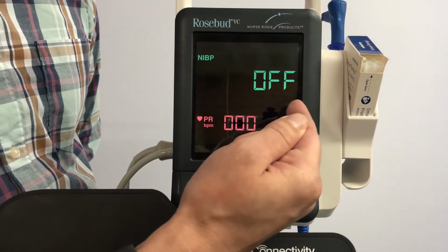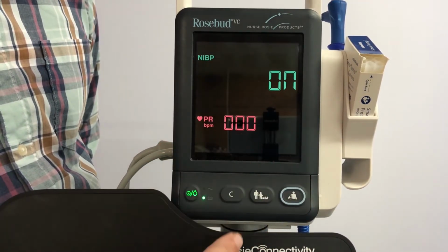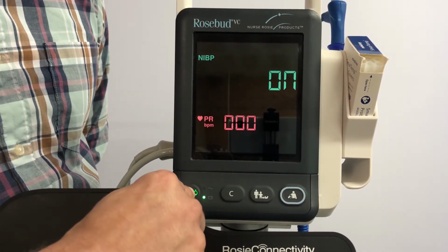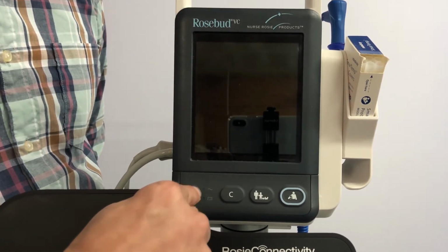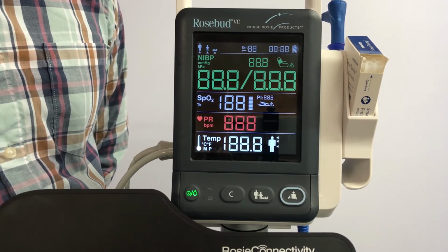When you see the word OFF displayed on the screen, you can cycle it to ON by pressing the blue blood pressure button. Once it is set to ON, power the device down again by pressing and holding the power button for 4 seconds. Again, you want the light to turn all the way off, not orange. Once the vital signs machine is powered down, press the button once to power it back on.